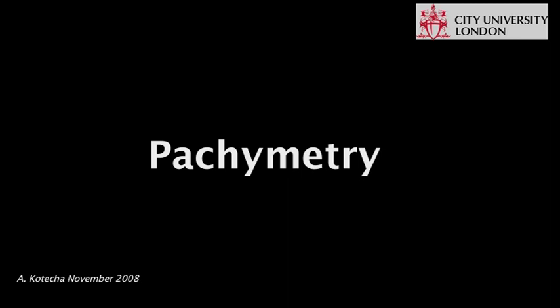Pachymetry describes the technique used to measure corneal thickness. It can be performed using optical, interferometric or ultrasound techniques. In the following video, we will use an ultrasound pachymeter.